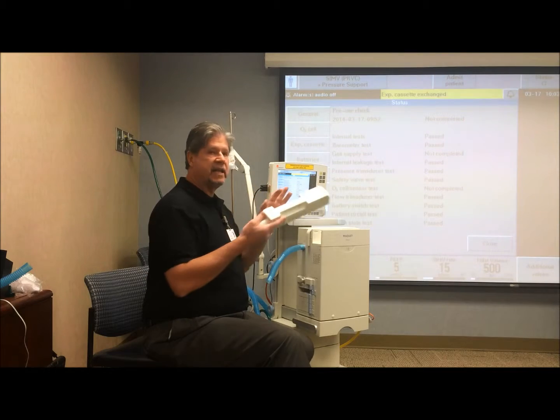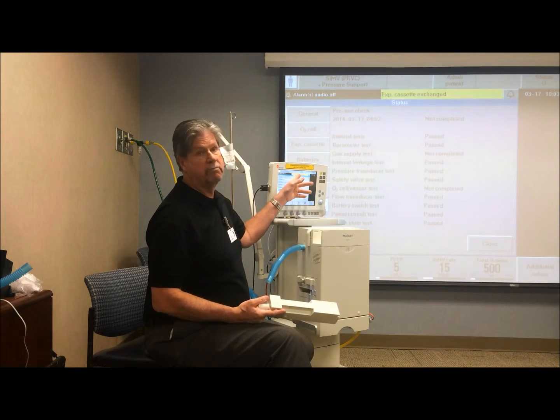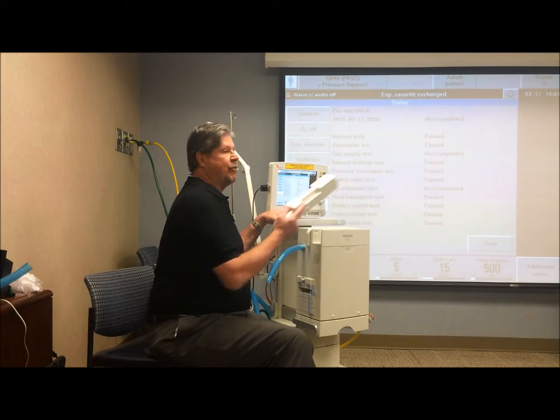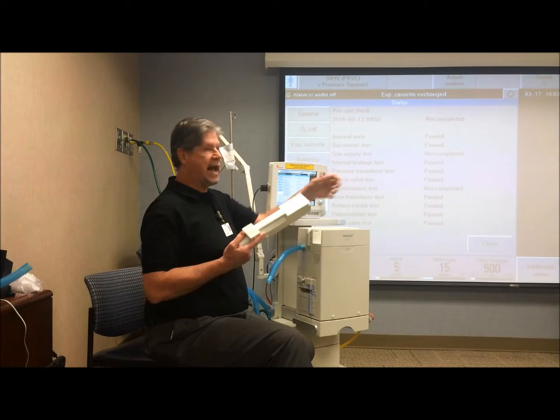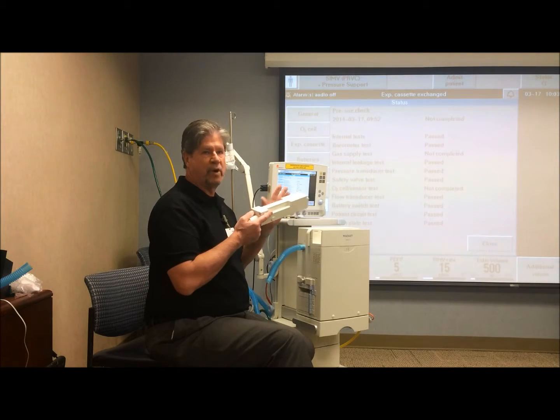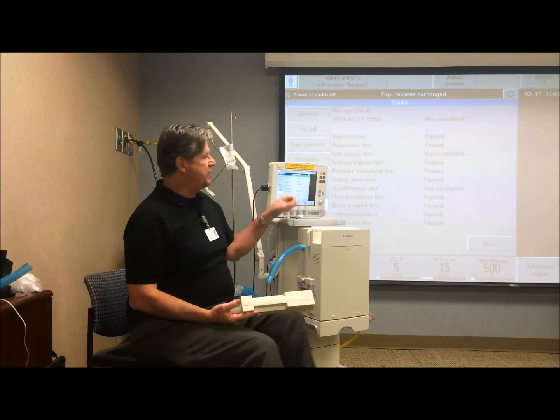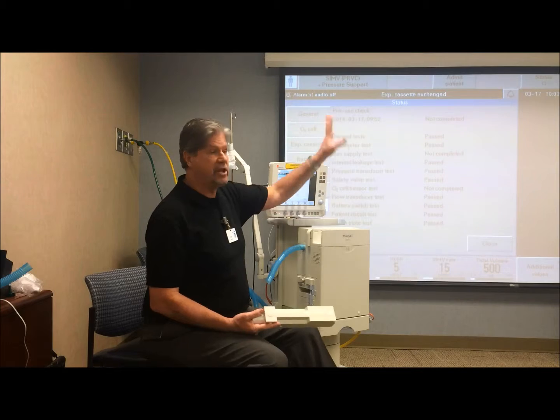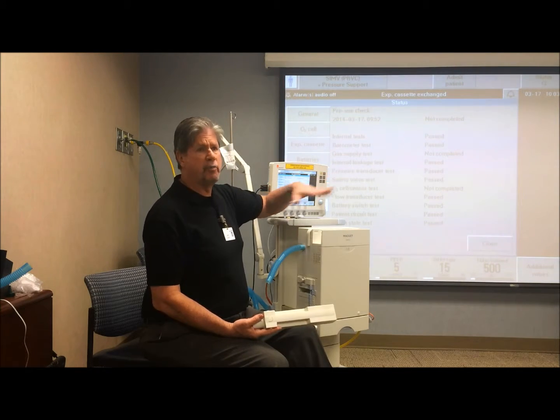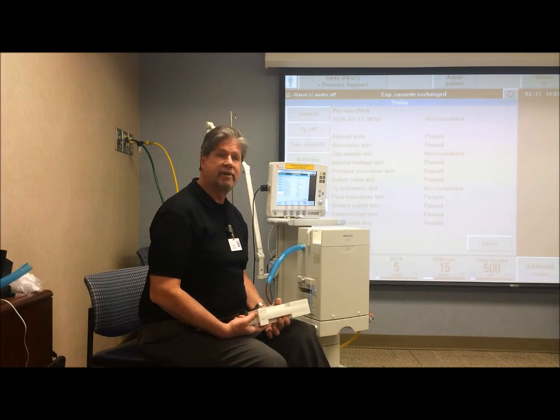So if you take this one out and put this one right back in again, that message won't appear, assuming that you did the whole thing. Even if you took this and put it in that one temporarily, and then took it out of that one and put it in here, it still remembers this one as the last one it shook hands with. But if you took that cassette and put it in here, you'd get the message, because it goes, I know your brother, but I don't know you, so I'm going to make you do the pre-use check again.